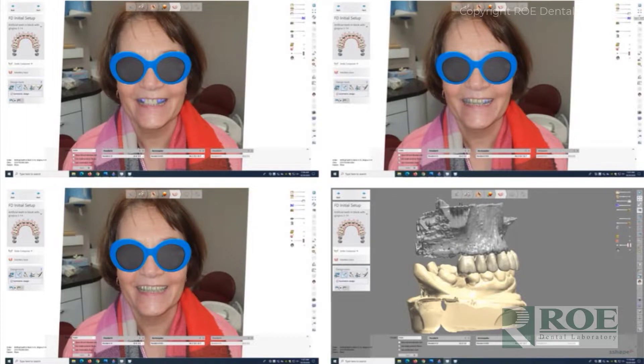Let's walk through the case. The records that come in are very typical for a Chrome case — a digital full arch templated procedure — which includes upper and lower casts, usually a centric occlusion bite, a palate for a backup denture, a CBCT scan with teeth apart, and photographs. Chrome cases really have simple, straightforward records: casts, a bite, a cone beam, and photographs.